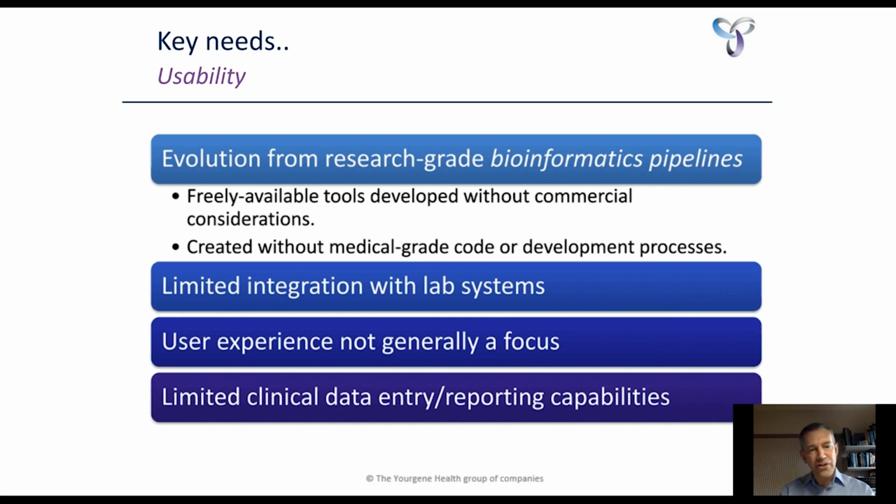And then some rather limited, often clinical data entry and reporting capabilities. Sometimes you end up having to enter the data into a system via a spreadsheet, for example, and then extract the results from maybe another spreadsheet, and then mail merge them onto a word processing package to get a test report. So not quite always as integrated as software could be on those fronts.